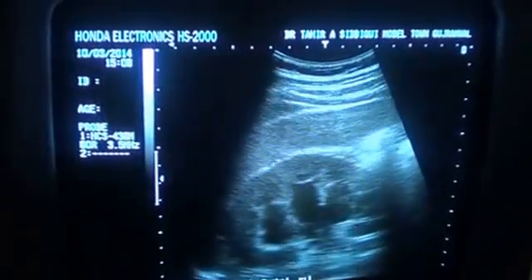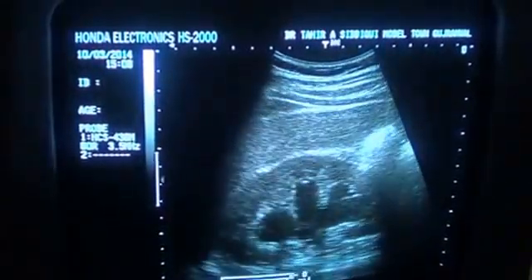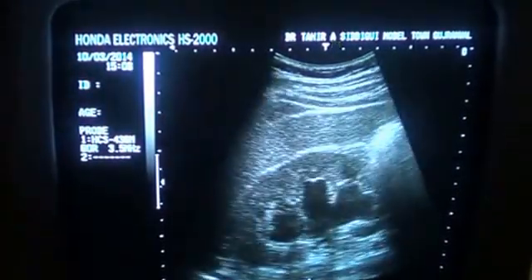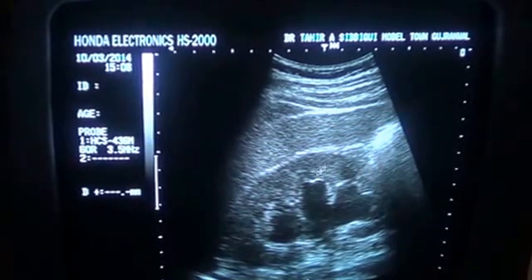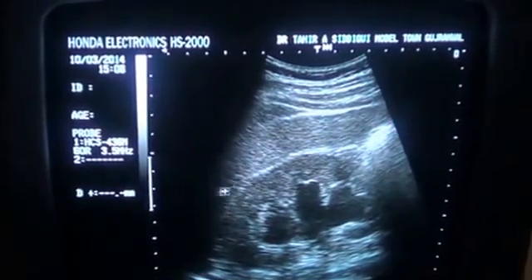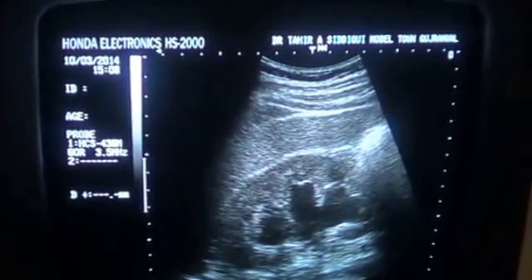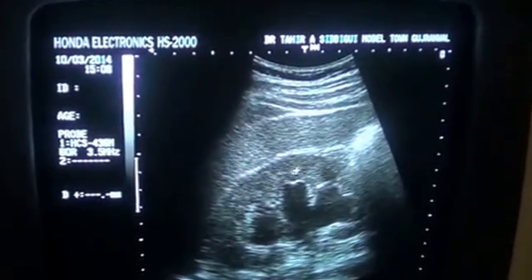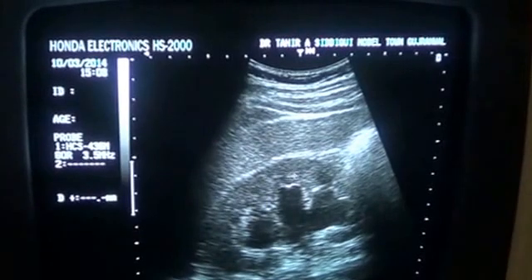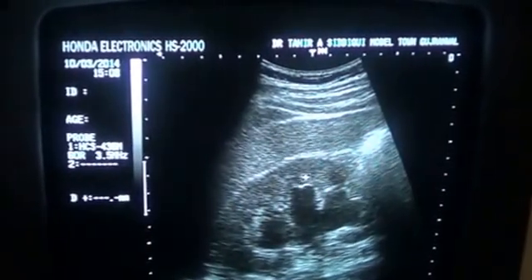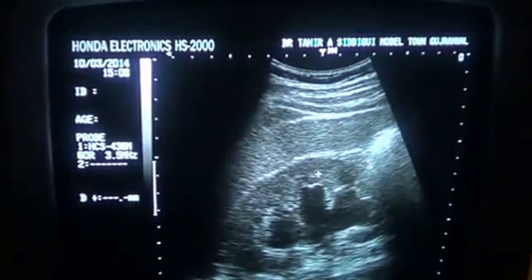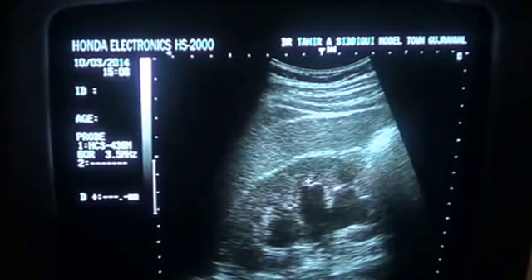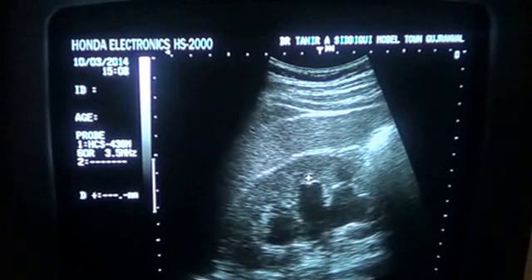This segment of study is showing dilated calyces and slightly prominent pyramids. Here I can show you a few things: this is the cortex, this is the capsule of the right kidney, this is the cortex of the right kidney, these are the medulla, and these tiny cystic areas. This small tubular structure is the arcuate vessel, seen at the anterior margin of the pyramid. This is the renal pyramid.